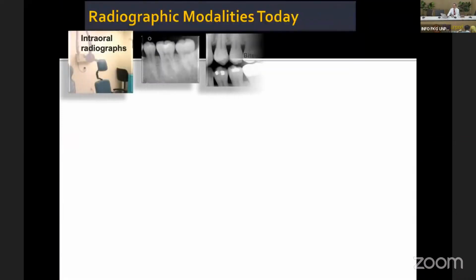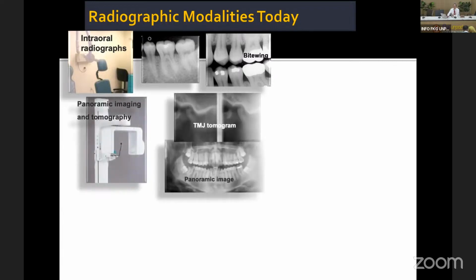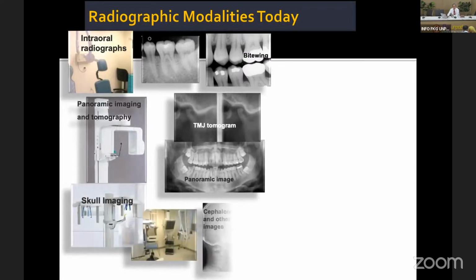Now, as we know, in dental maxillofacial imaging, right now we still use intraoral and extraoral radiographs. Intraoral, we have bitewing and periapical radiographs. Extraoral, we use panoramic radiographs and cephalometric radiography.